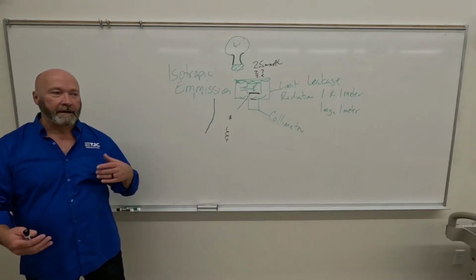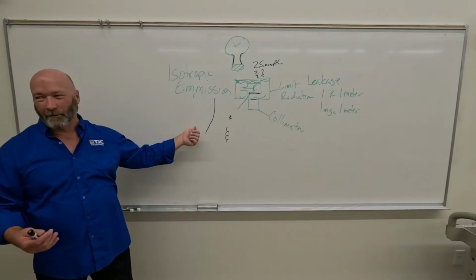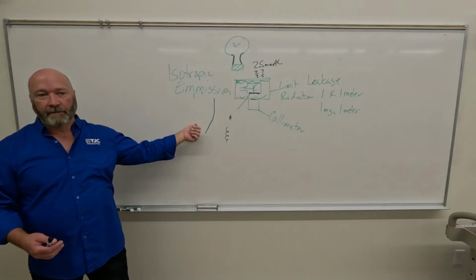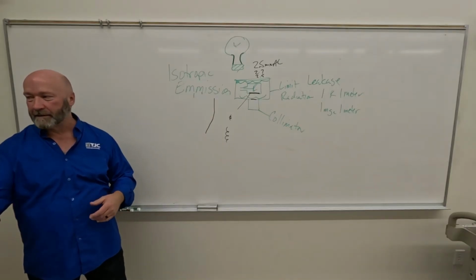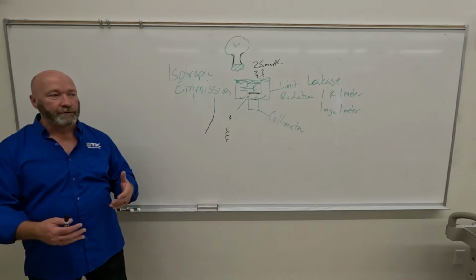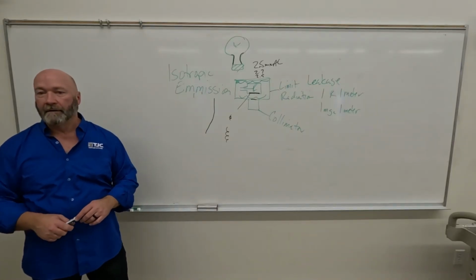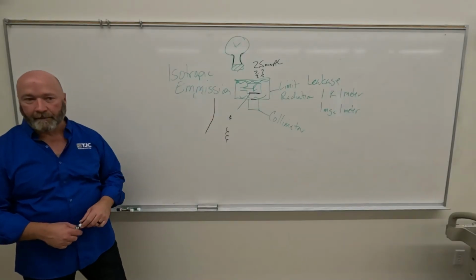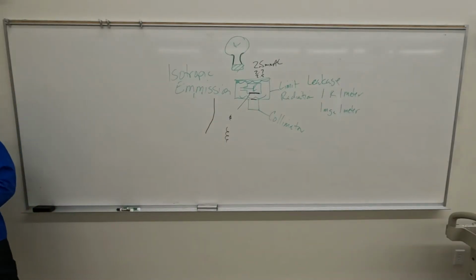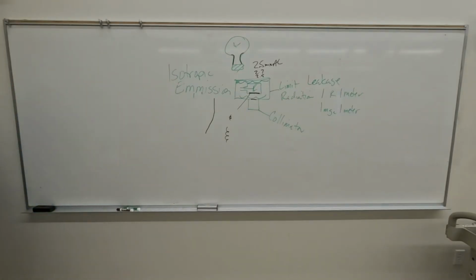If you go to work in interventional cardiac catheterization, something like that, you won't know it, but that's probably what you're going to have, a bi-bevel X-ray tube. And that's what he's talking about. Most of your tubes, the filaments are going to be side by side, just like the one I passed around earlier. They're all bifocal, but they're not all bi-bevel. Okay.